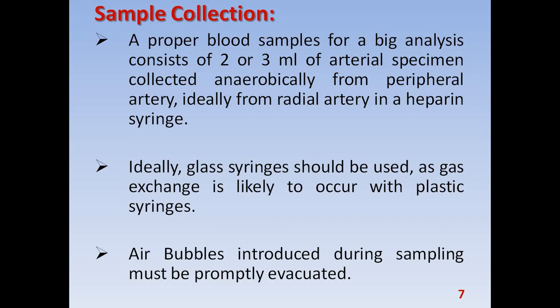Allen's test. Allen's test is actually the physical examination of arterial blood flow to the hands. This test is usually done before taking the sample, and we usually do the modified Allen's test. Okay, and I will tell you how to do the modified Allen's test.